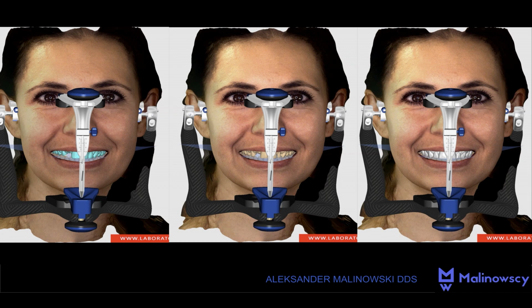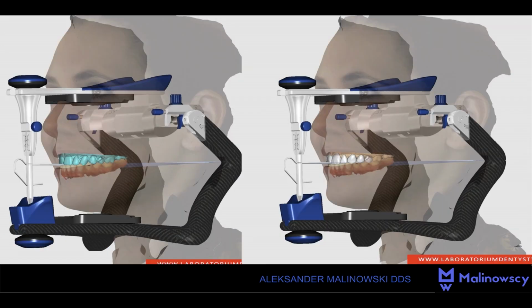Thanks to RiScan technology, accomplishing this task is possible using standard settings. To replicate individual jaw movement, integration with an electronic face bow is essential. Nevertheless, even in the absence of such a tool, working with RiScan ensures higher accuracy than traditional methods without the face bow.